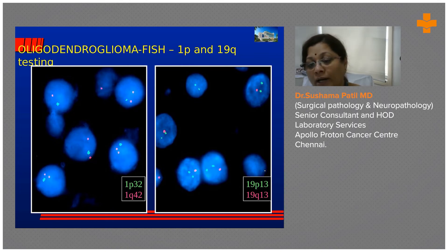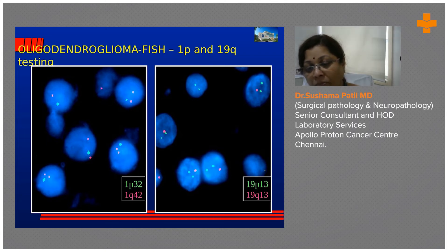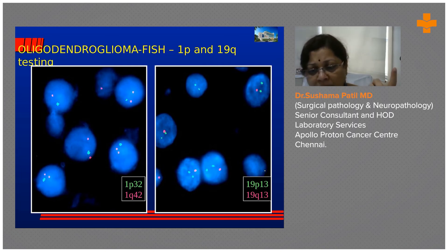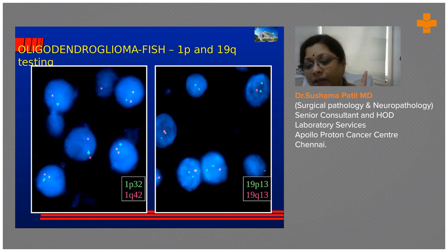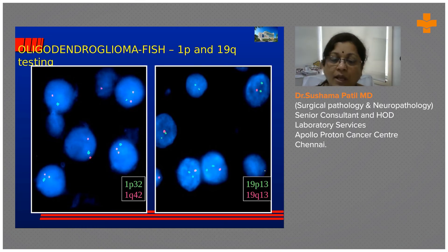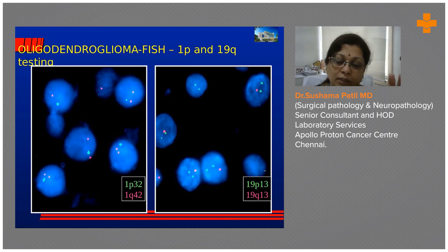On the right-hand side we look at 19q. The test probe is red and the reference probe is green. Normally you see two copies of each probe since chromosomes are paired, but here the red test signal shows only one copy, indicating loss of 19q. So 1p is lost on one side and 19q is lost on the other. With IDH positivity and retained ATRX, this 1p/19q co-deletion is the hallmark feature of oligodendroglioma.